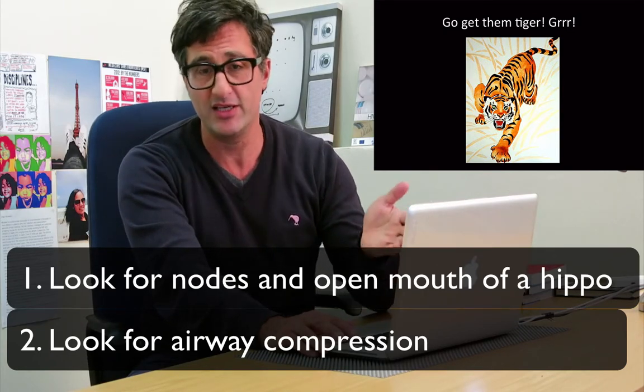Now, this is not histological confirmation or laboratory confirmation. It's for you to use at the point of care to help you when you suspect TB while you're waiting for culture or other tests.